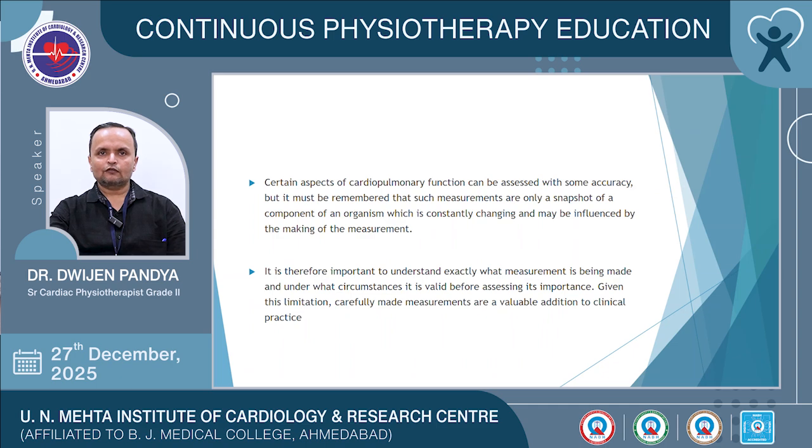Certain aspects of cardiopulmonary functions can be assessed with some accuracy, but it must be remembered that such measurements are only a snapshot of a component of an organism which is constantly changing and may be influenced by the making of the measurement. It is therefore important to understand exactly what measurement is being made and under what circumstances it is valid before assessing its importance. Given this limitation, carefully made measurements are a valuable addition to clinical practice.